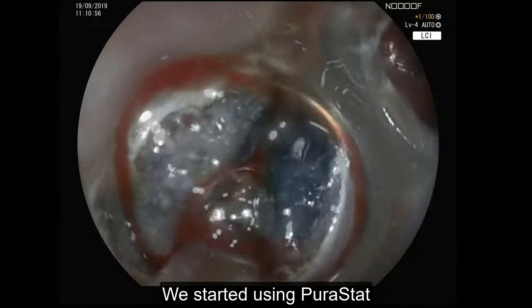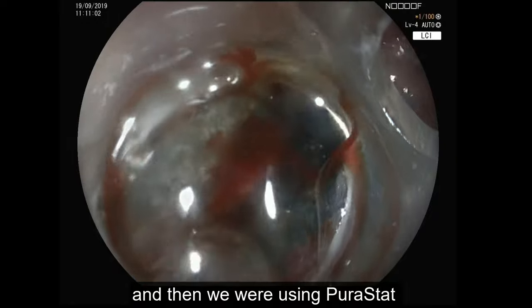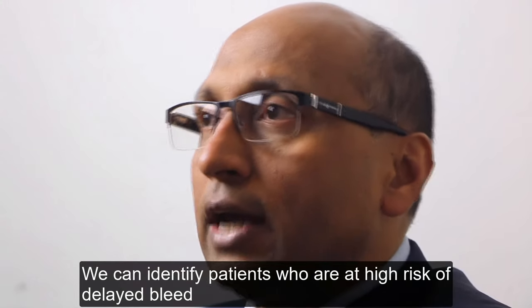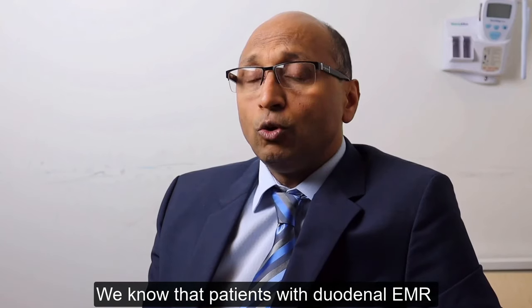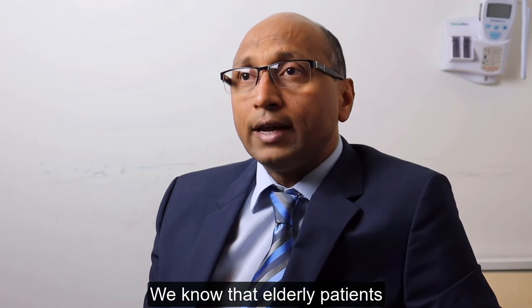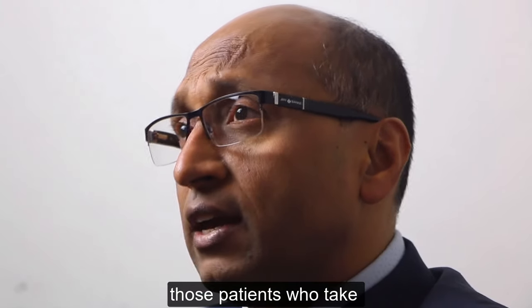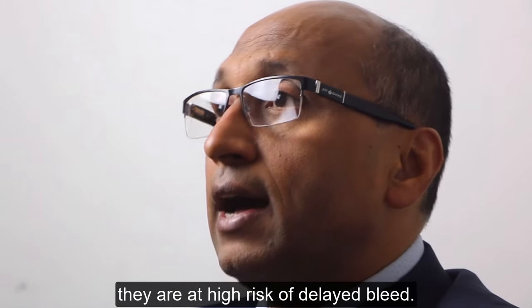We started using Purastat for all the intraprocedural bleed, and then we were using Purastat to reduce the risk of delayed bleed after resection. We can identify patients who are at high risk of delayed bleed as compared to those who are not at high risk. So we know that patients with duodenal EMR are at very high risk of delayed bleed. We know that elderly patients or those with right-sided large colonic lesions, those patients who take aspirin and clopidogrel or have multiple comorbidities, they're at high risk of delayed bleed.